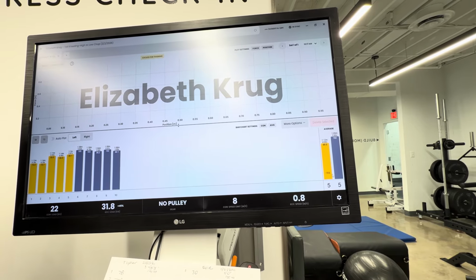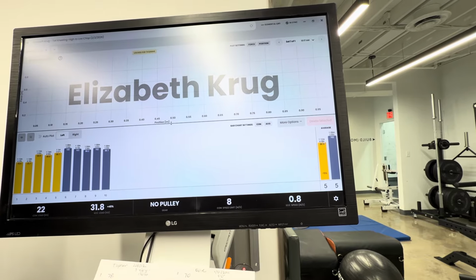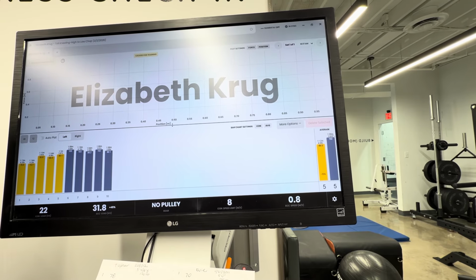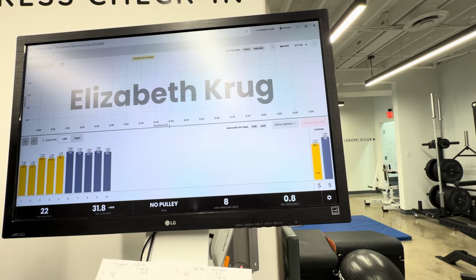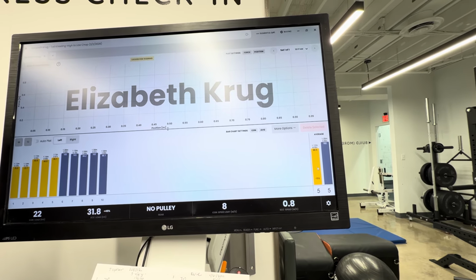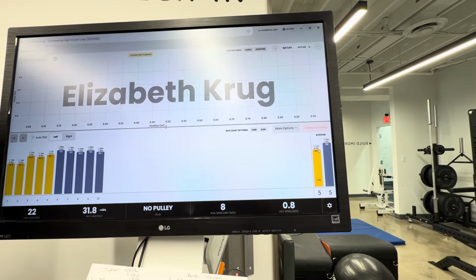So you see that there's a 15% difference in strength from left to right in a tall kneeling position. So this is something that I would definitely address. This top number here, 1.12 meters, is how long the cable turned. I ideally want to see them close to each other, so that's good because left versus right, they're quite similar. This number under here, 4.08, 3.88, is time under tension. And ideally we want to be around 3.5 seconds. So she, on the left side here, had more time under tension as well. So it was definitely weaker, and that was demonstrated with how long it took her to complete each repetition.